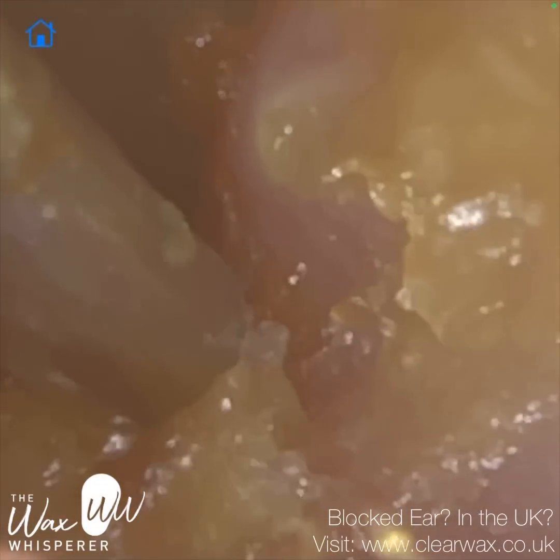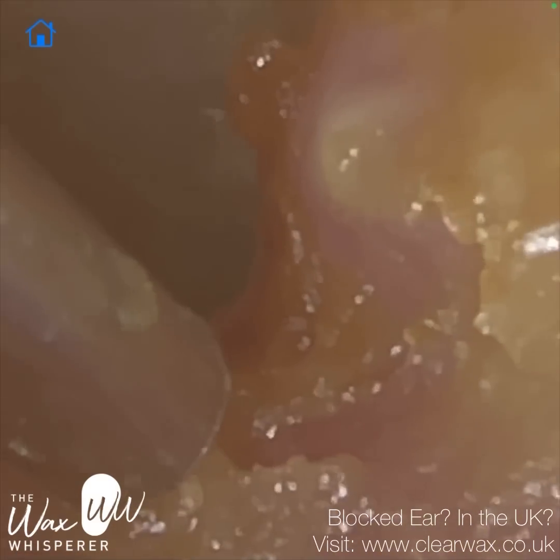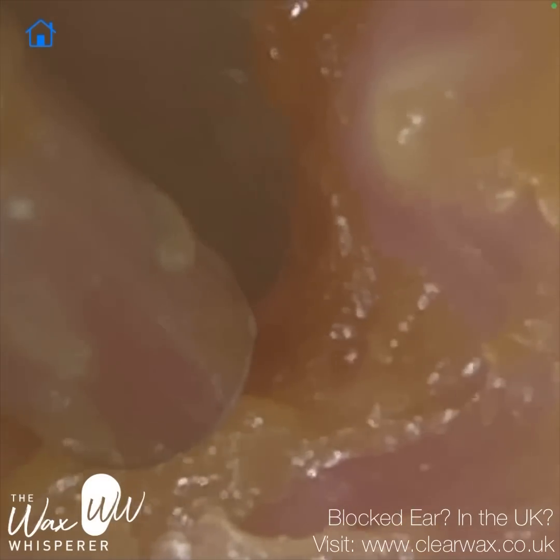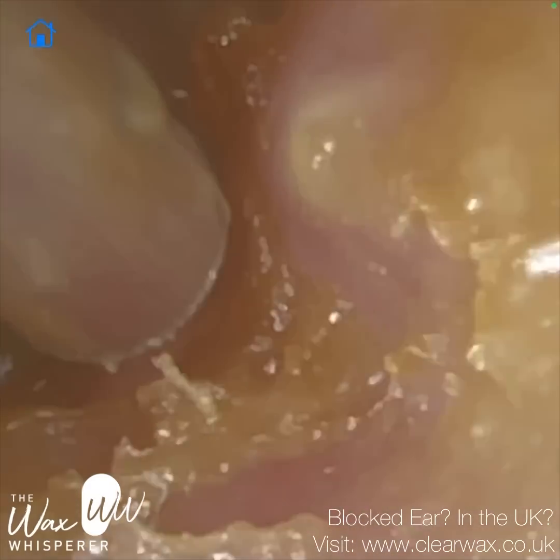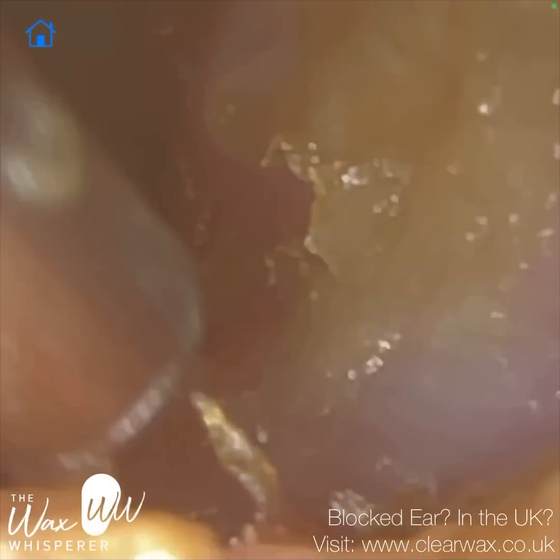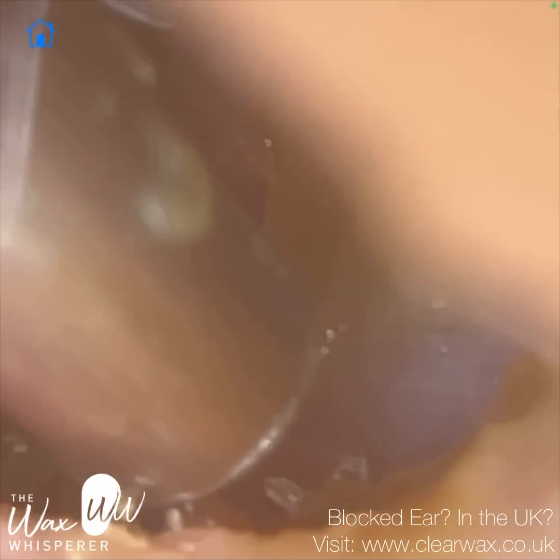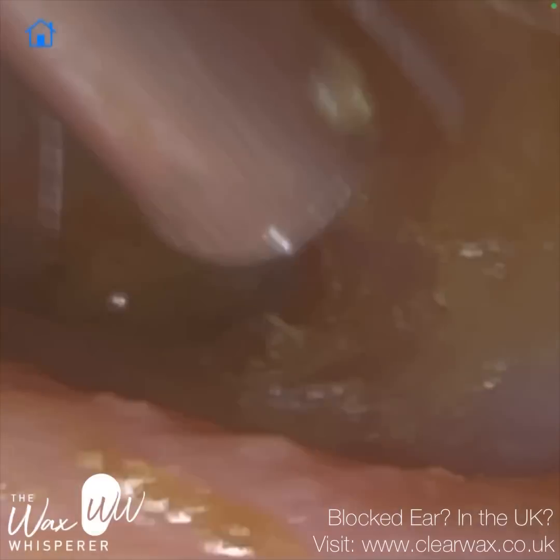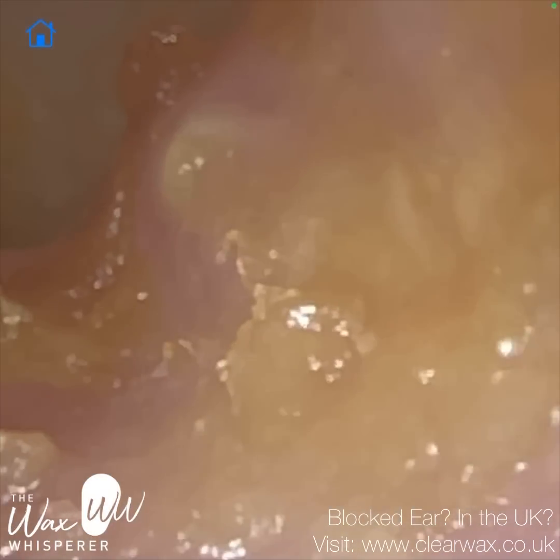I've just zoomed in here. Because we're removing some debris and dead skin off the canal wall, I thought this was a good opportunity to try the zoom, so I can really get up close with the dead skin. It gives me more precision — I'm more able to avoid touching the canal wall. You can see just to the right there, the patient has got a bit of a bony protrusion, and there's a bit of dried skin there. We just want to make sure there's nothing sinister behind that dry skin, so in a moment I'm going to gently vacuum over the bony part of the ear canal. We've got to be very careful when operating around the bony part of the ear, because it is very sensitive.